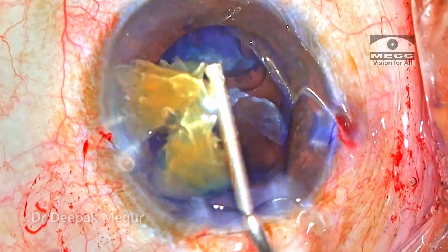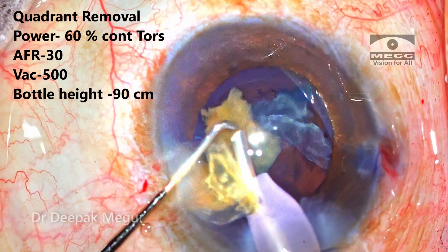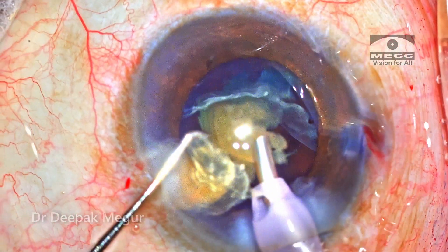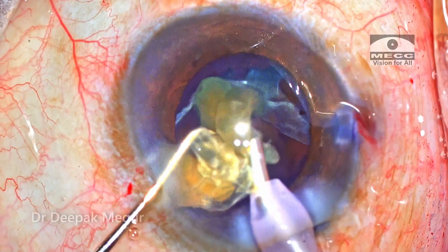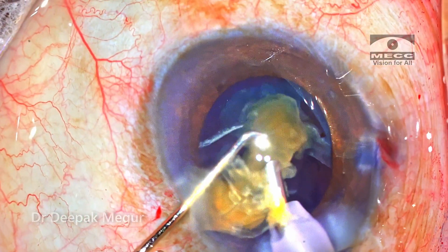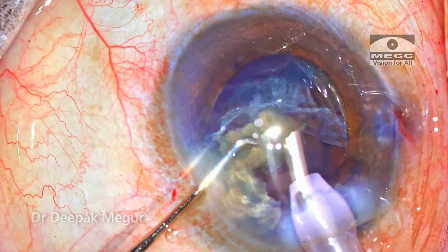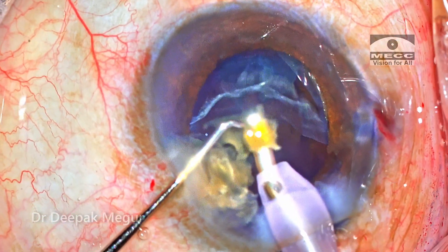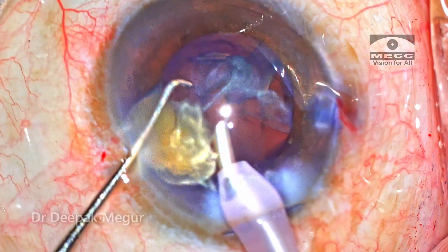OVD is pushed in to provide adequate tamponade, and I'm going to use continuous torsion energy to emulsify this fragment in such a way that turbulence is minimized to whatever extent possible. My major worry at this point is the amount of endothelial damage it is going to cause, since I'm very close to the endothelium during this emulsification process. The first piece is emulsified.